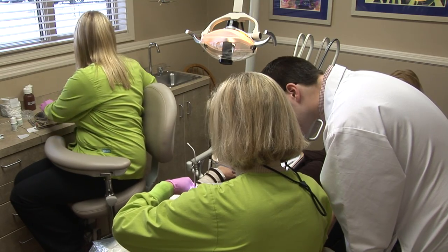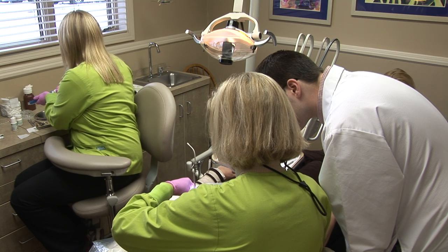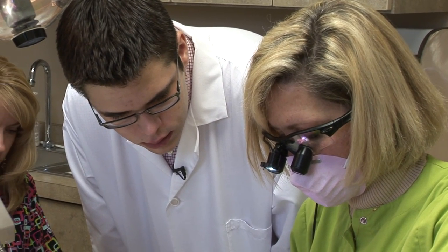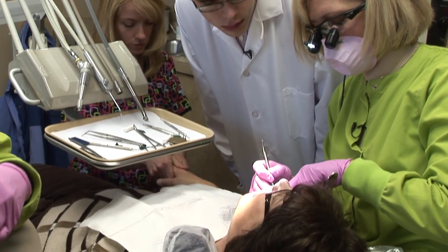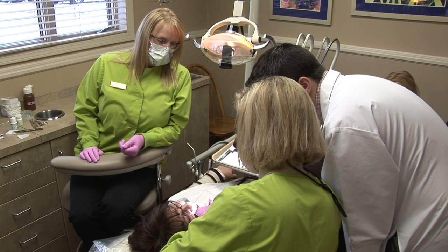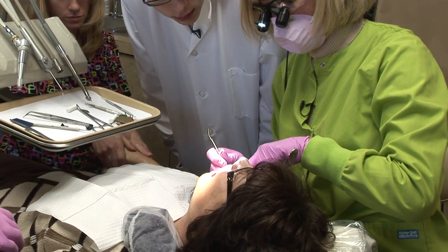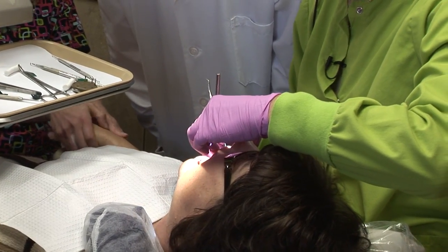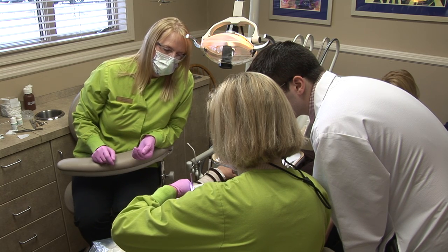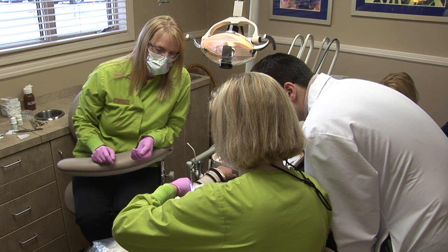The only reason we're doing this is I want to capture in a mold of this tooth all of these margins perfectly well. So if I push this in between the tooth and the gum and let it sit for a couple minutes, it creates a nice little crevice — like a moat — around the tooth that after it's gone, fills right back in and the tissue collapses right back in in a few minutes. It's not the string itself, it's the medication it's impregnated with that is doing the work. The string adds a mechanical separation, but the medication acts on the tissue to cause the change.